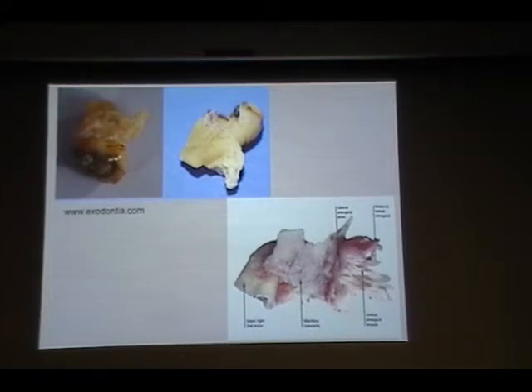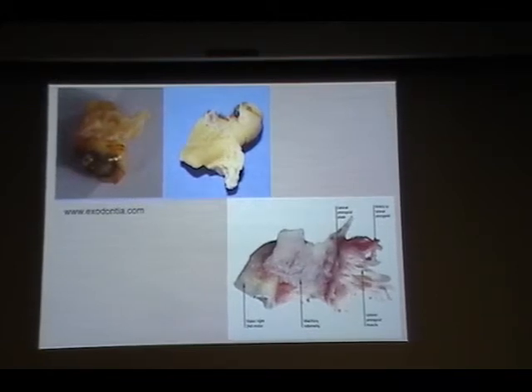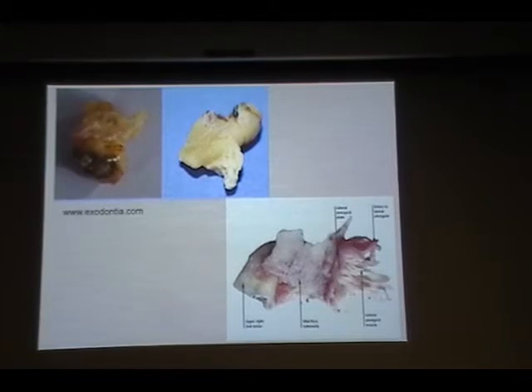To answer your question, the term that radiologists prefer to use is osteopenia, not osteoporosis. Two different things. Osteopenia is when you are seeing less trabecular pattern and the cortical plate is very thin. Then you can say it is leading towards osteopenia. Without a lab diagnosis, you cannot definitively say this patient has osteoporosis.